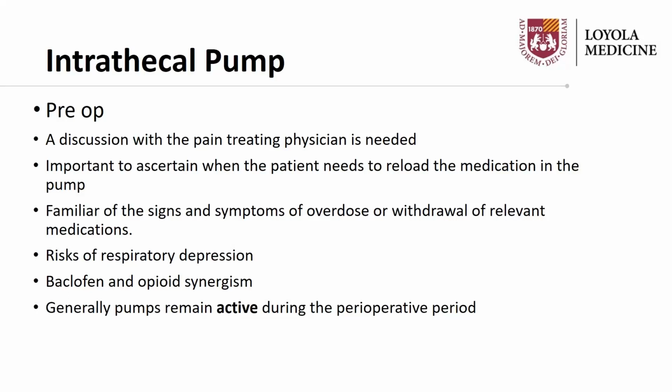Generally, these pumps remain active during the perioperative period, so there is no need to disable them or turn them off.